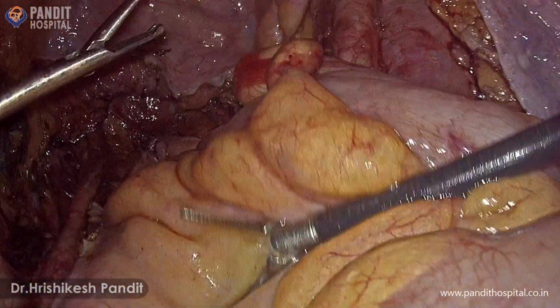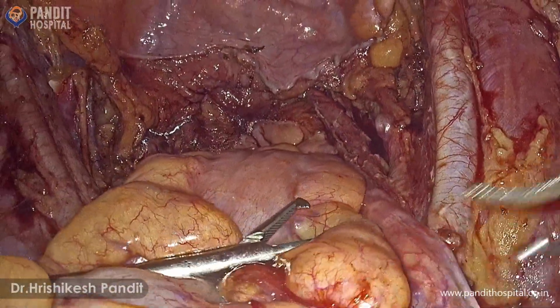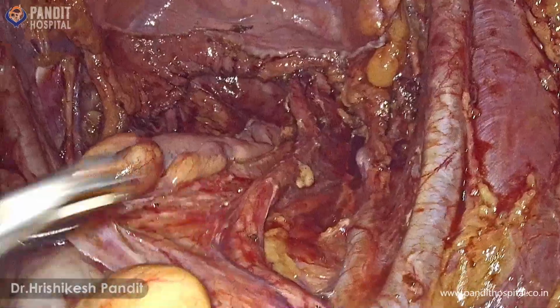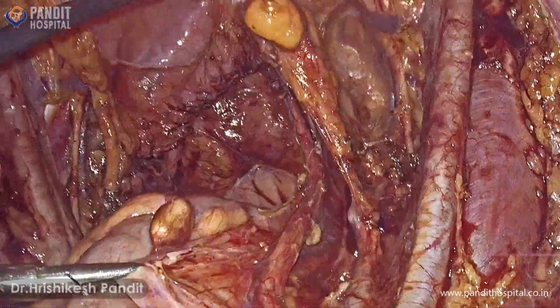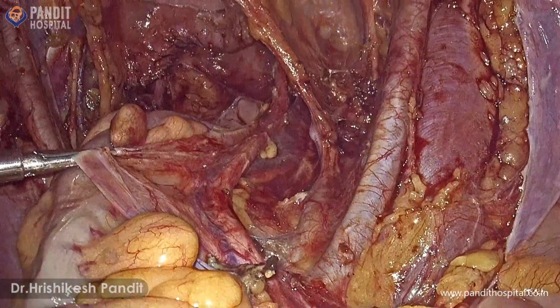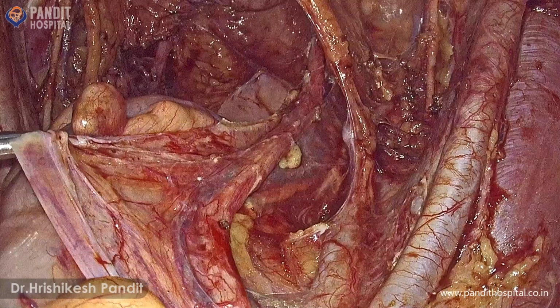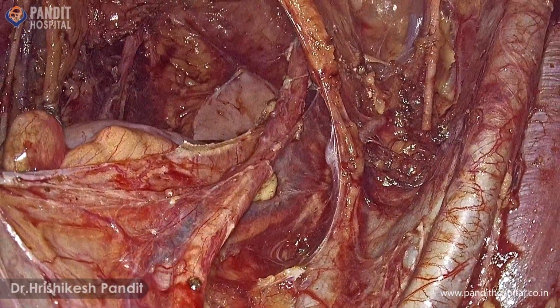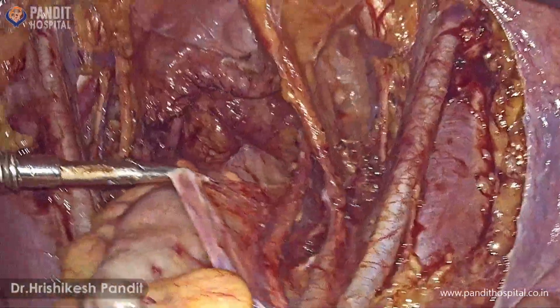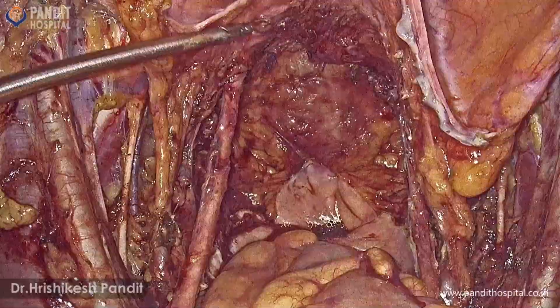Here we can see the entire ureter dissected from sacral promontory up to its entry into the bladder with conserved vascularity. Here we can see the bifurcation of common iliac into external and internal iliac, and the peristaltic movements of ureter can be visualized. This is the final picture.